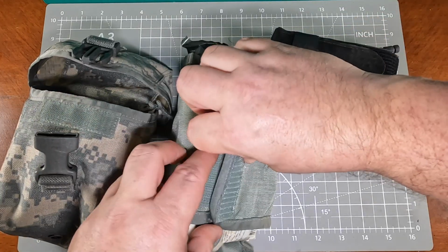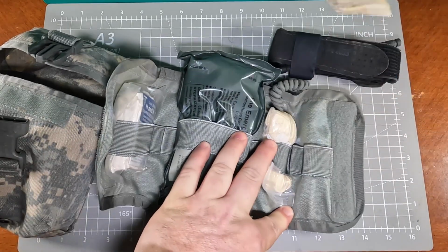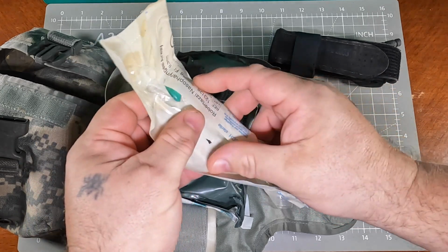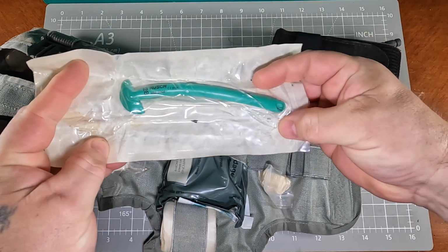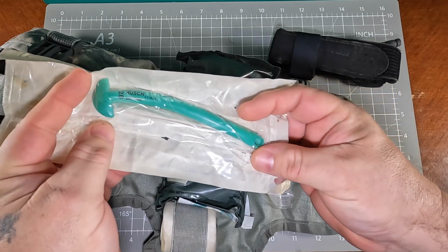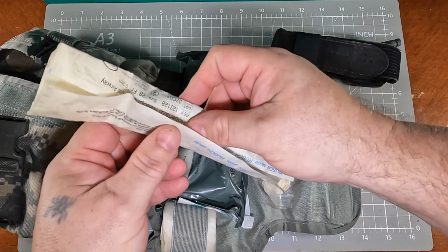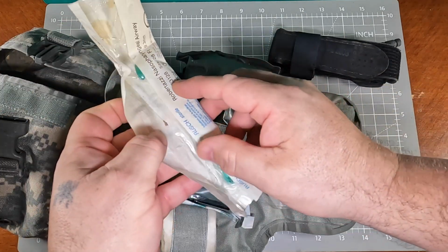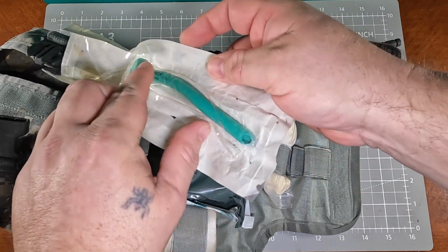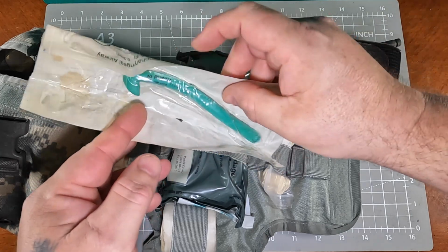When you open up the kit, it'll come with a nasal tube. If you got an injury or something like that and you weren't able to breathe too well, they have a nasal tube. Normally you'd measure it from like your ear line to your jaw to make sure it's the right size. Most adults all use the same size, so in the military, pretty much one size fits all. You do need to put a little bit of lubrication on it, and then you want to be careful with the beveled end, and then stick it down someone's nose if they're having trouble breathing, whether it's from a head injury or something like that.